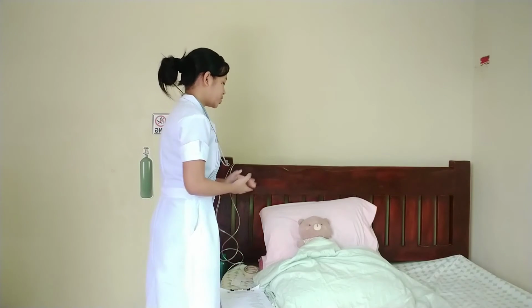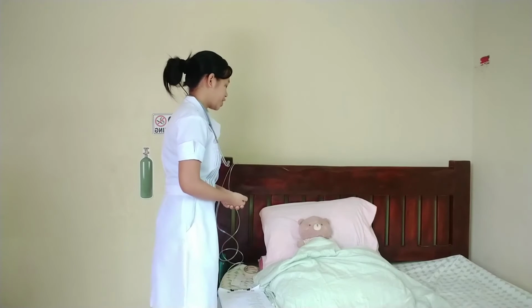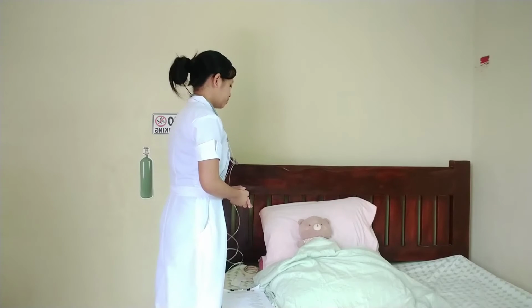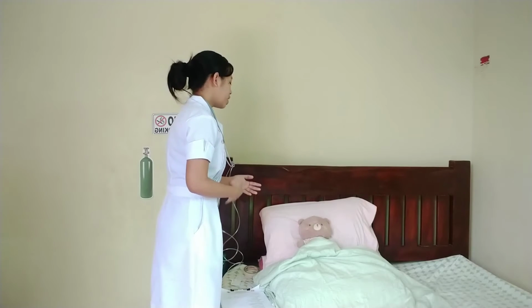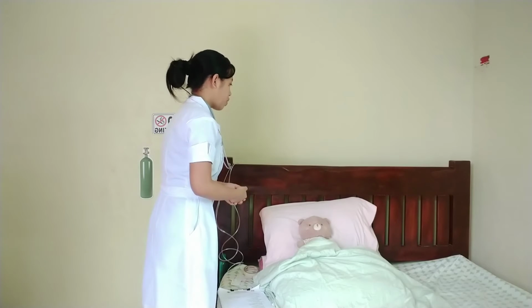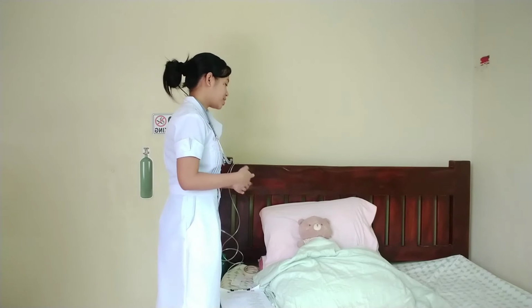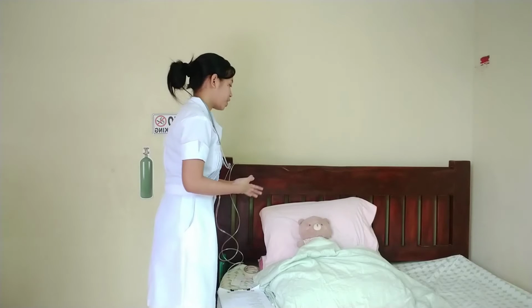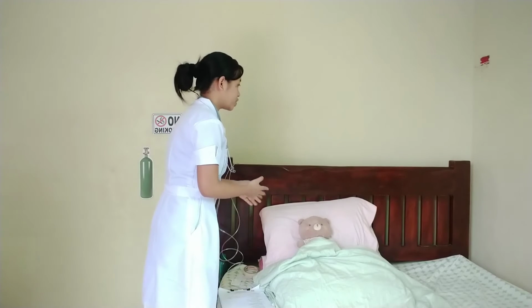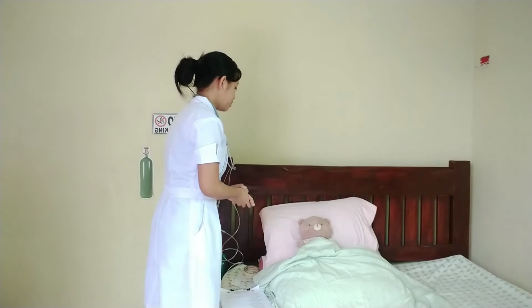I'm Nasal, your student nurse for today. May I know your name? Okay, ma'am. How about your age? Okay, good. So, today, I will be administering oxygen via nasal cannula. So this is to provide you easier breathing, also to deliver a low amount or concentration of oxygen, because you need a minimum oxygen support. Will that be okay?